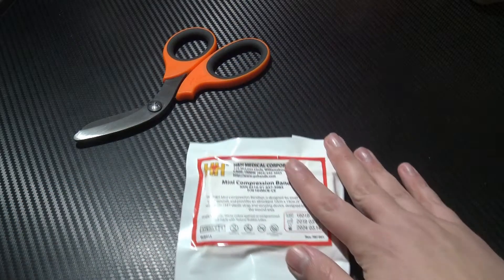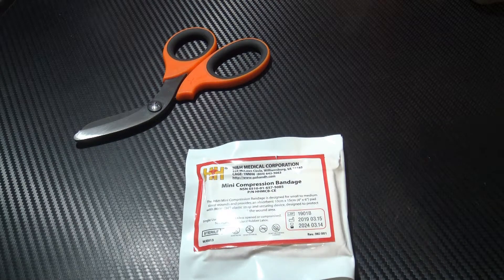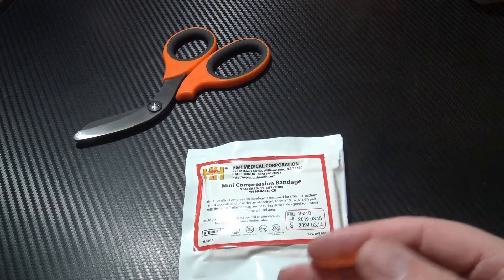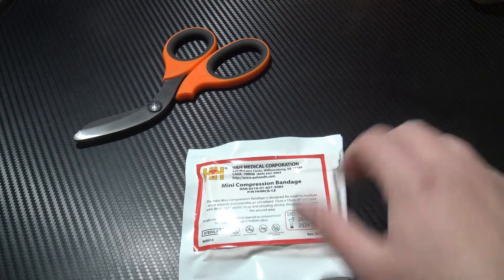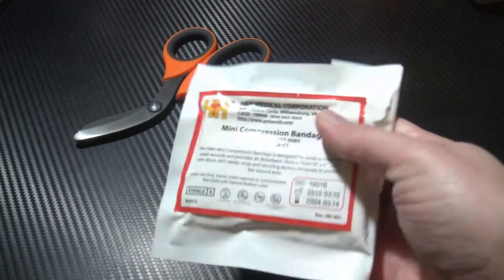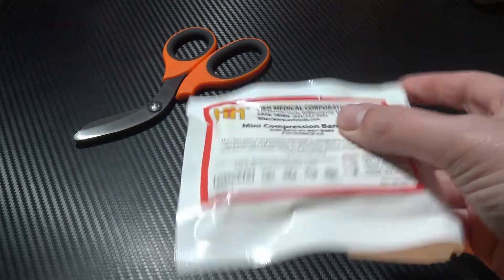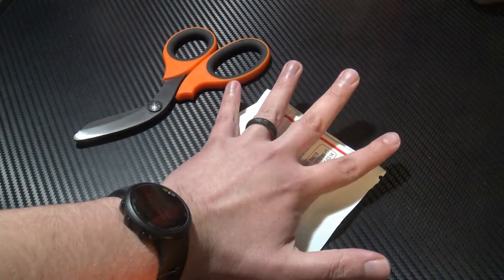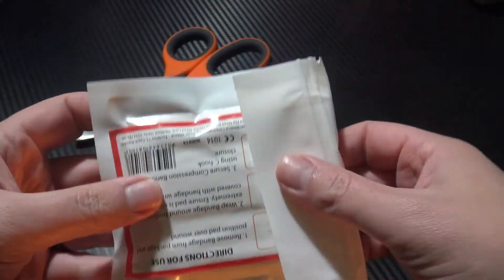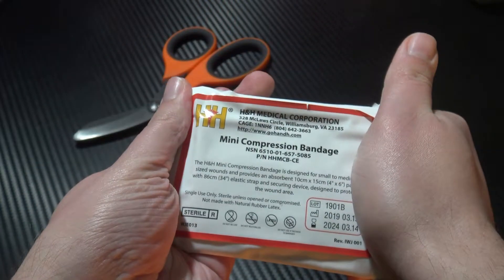This is made from an elasticated bandage material and it has a four by six inch absorbent pad which is suitable for a wide range of injuries. It comes with four feet of the elasticated bandage and it is literally less than an inch thick. If I just put this in my hand, you can see this thing is tiny, has a really small footprint and you can actually fold these bits to give it an even smaller footprint.